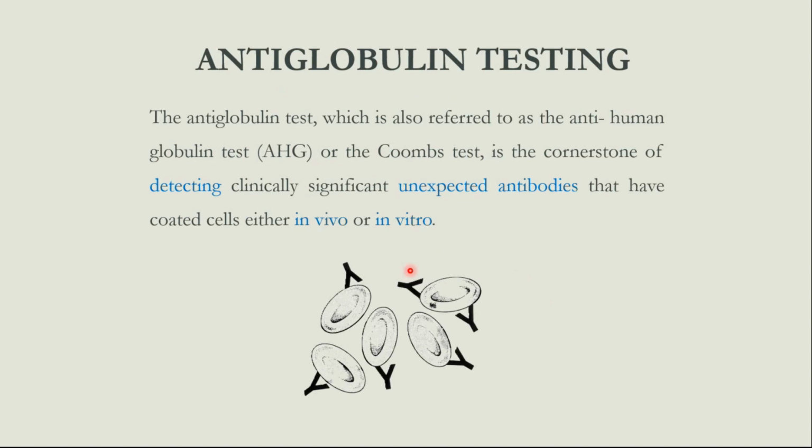Okay, what is antiglobulin testing? The antiglobulin test, which is also referred to as the anti-human globulin test or the Coombs test, is the cornerstone of detecting clinically significant unexpected antibodies that have coated red cells either in vivo or in vitro.